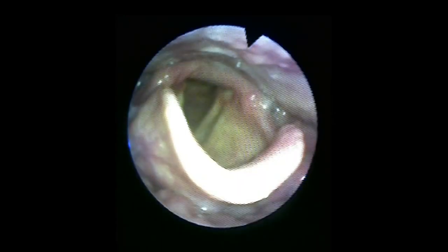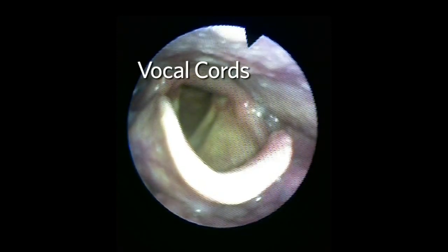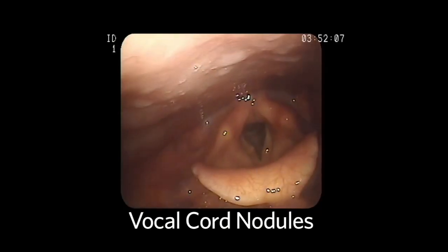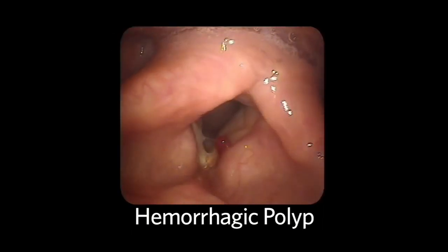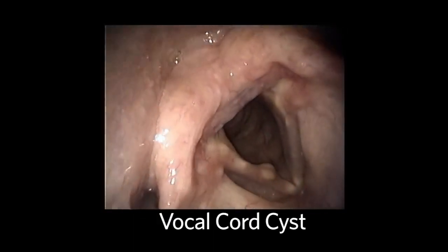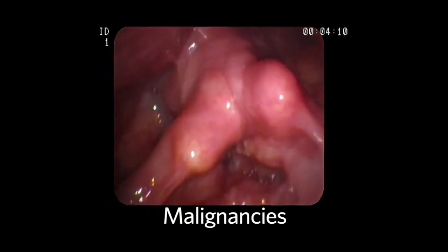At this point, the larynx and hypopharynx are examined. We typically see smooth, straight vocal cords bilaterally, which are usually white in color. Common pathology that can be seen on the vocal cords include nodules, polyps, cysts, and malignancies.